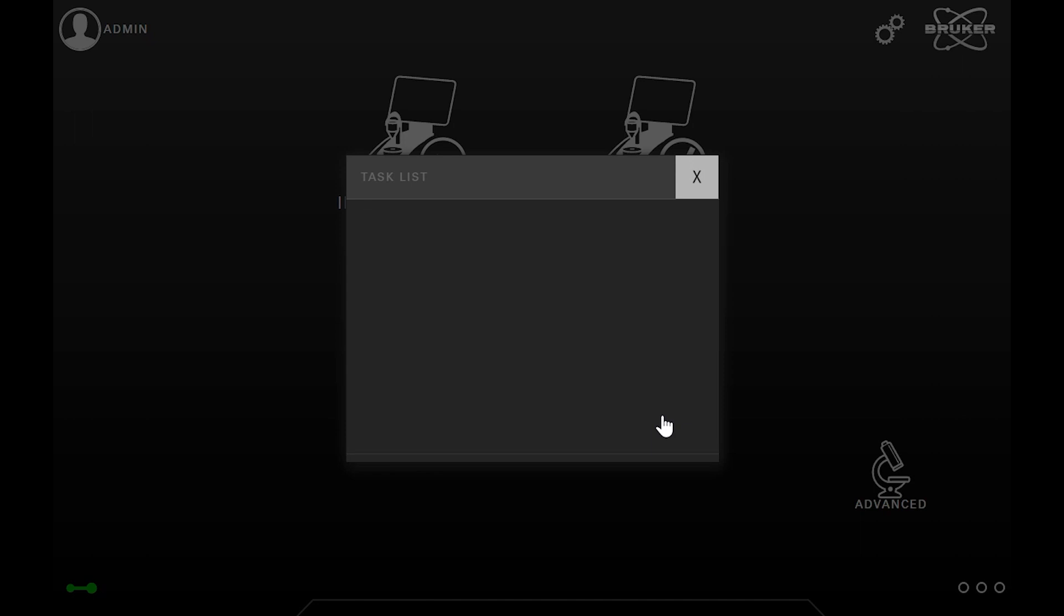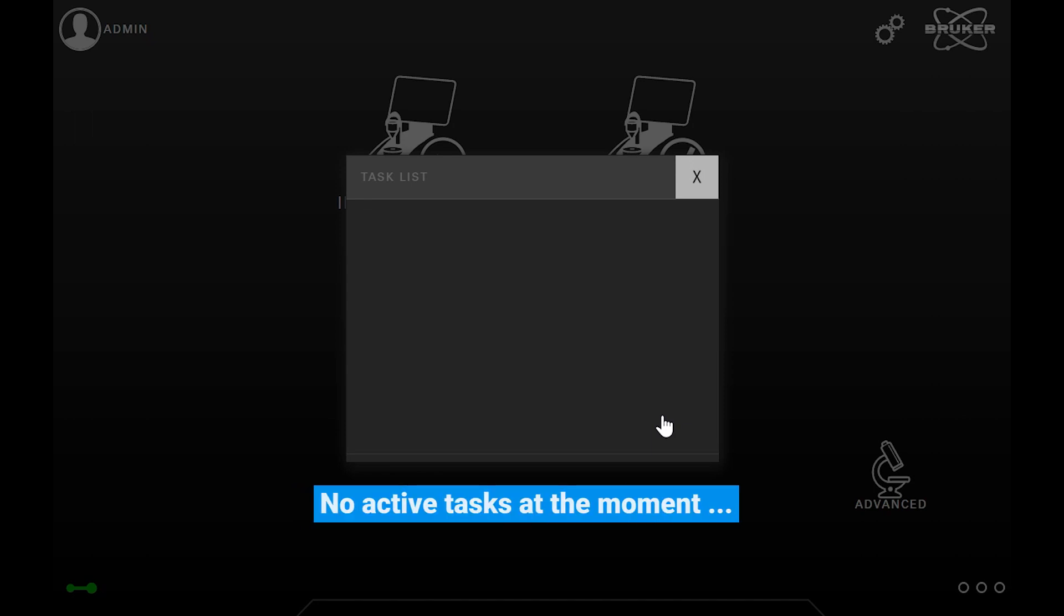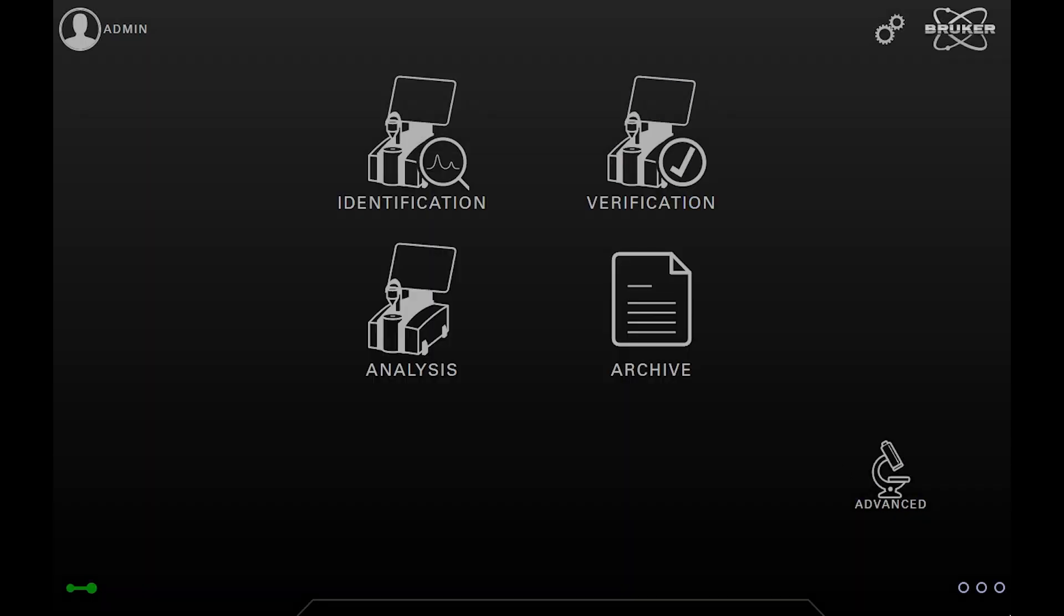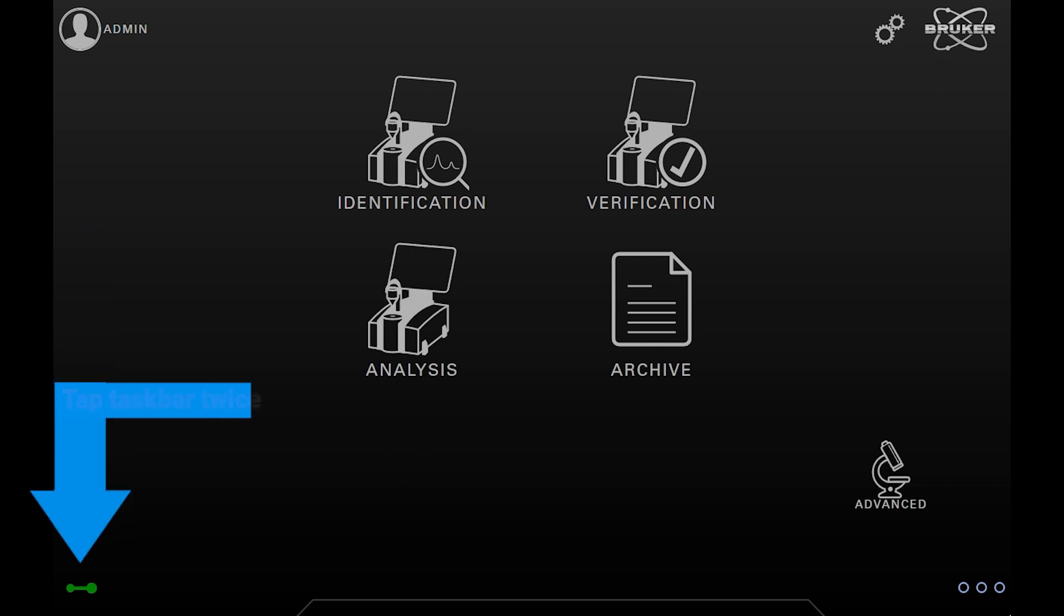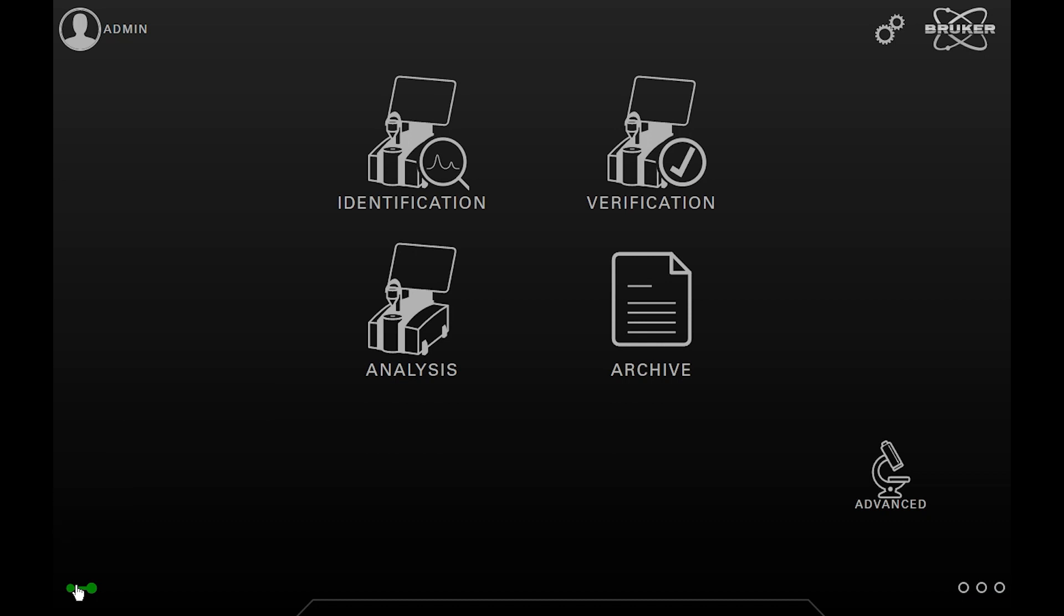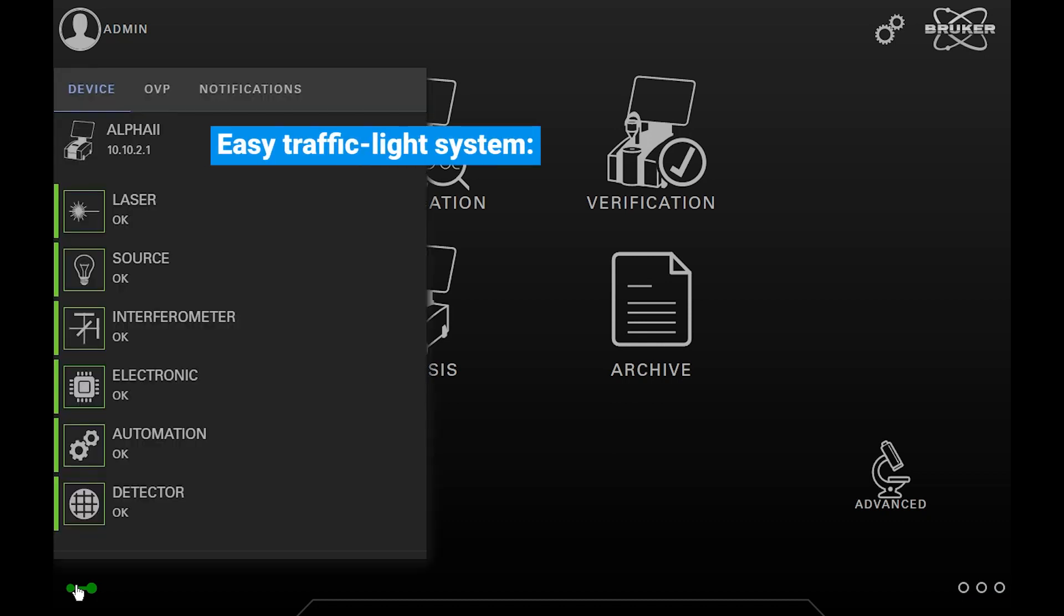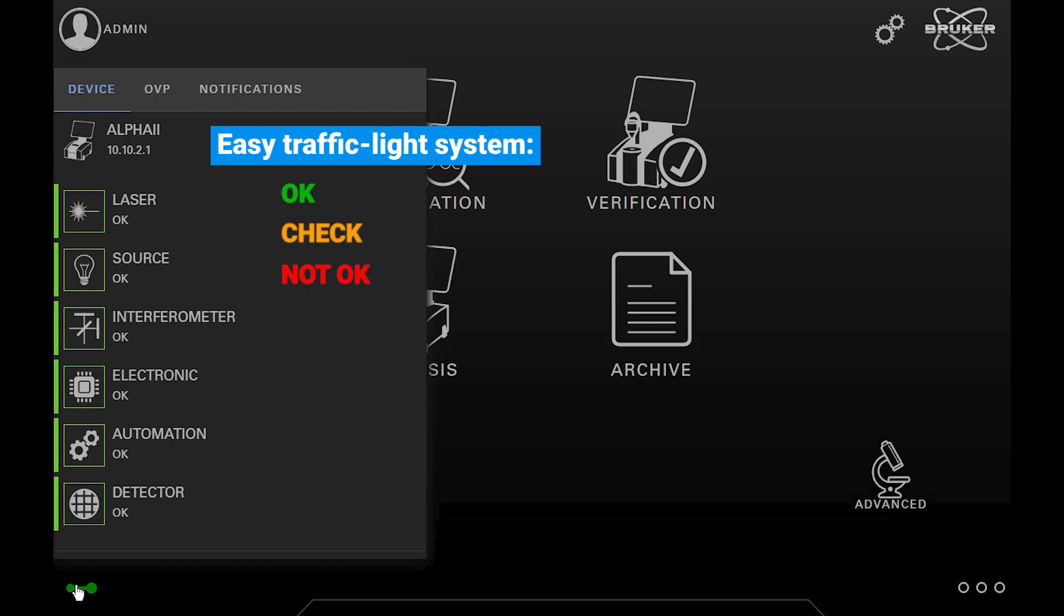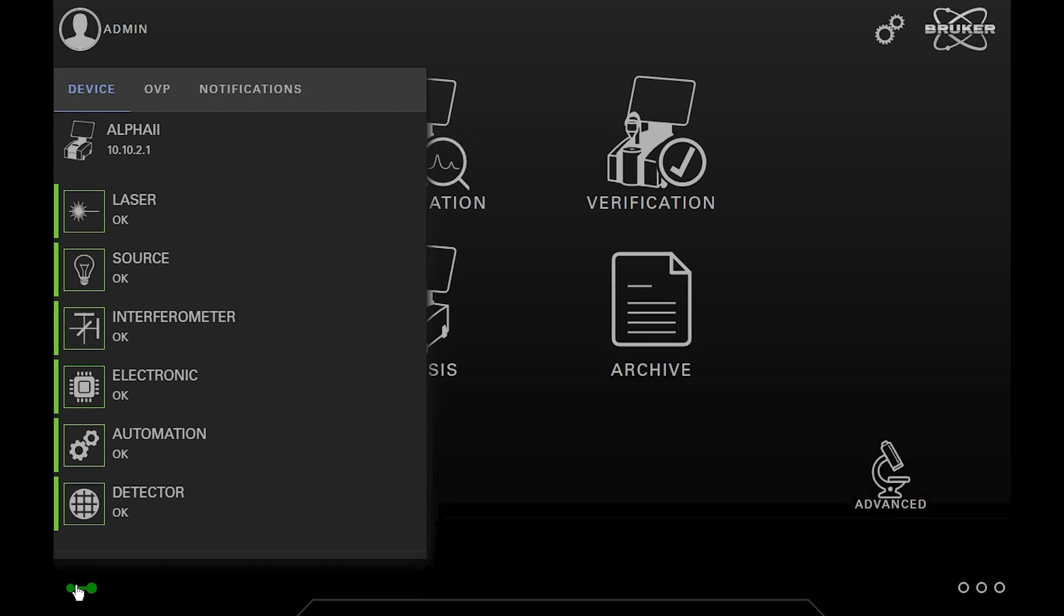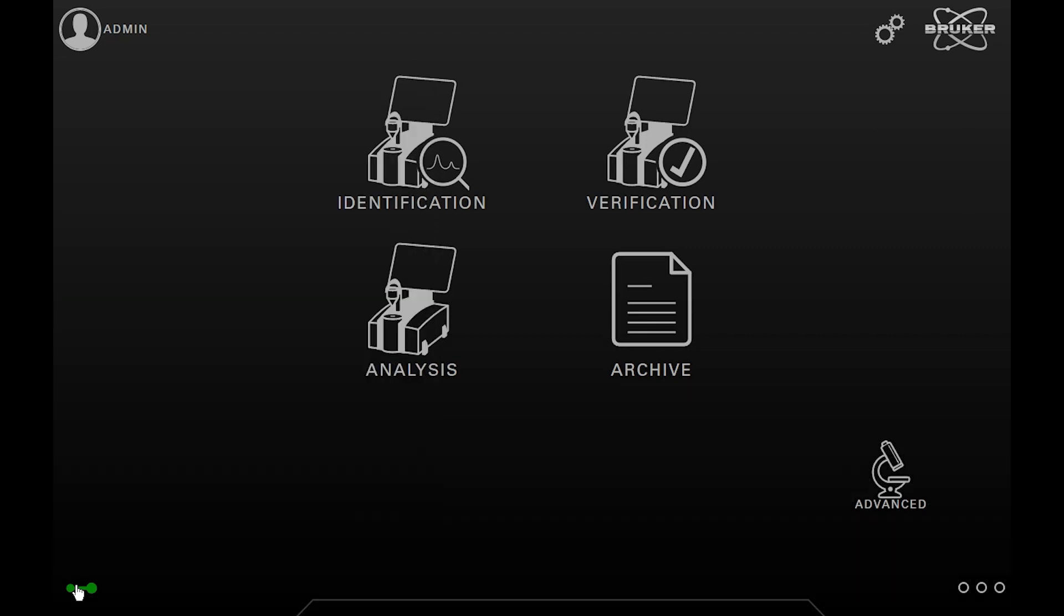In the lower left corner, you can see the status icon. If you tap on it, you can see information about the hardware components and test status. In the upper left corner, you can see the currently logged-in user.